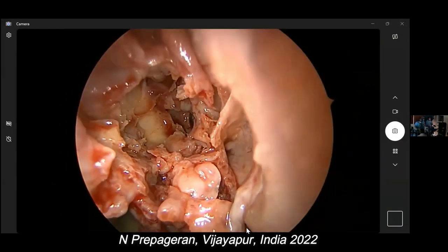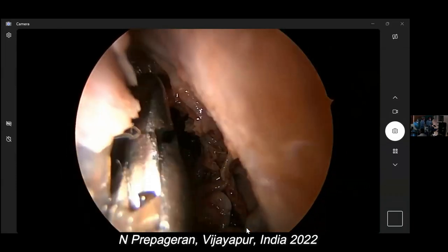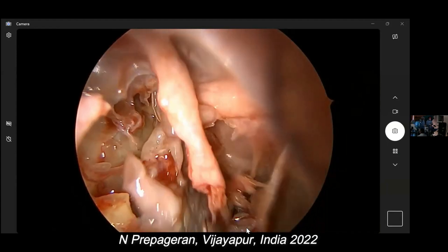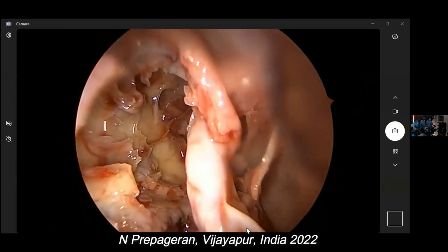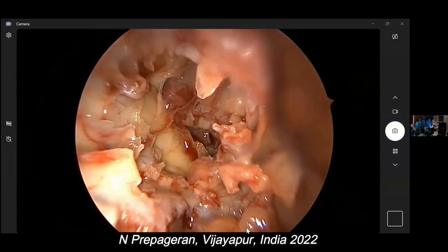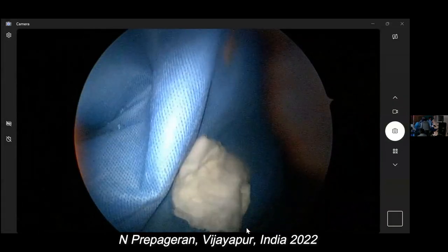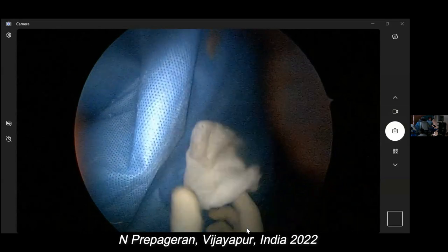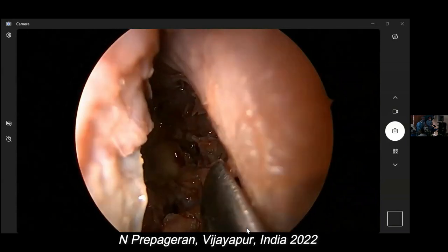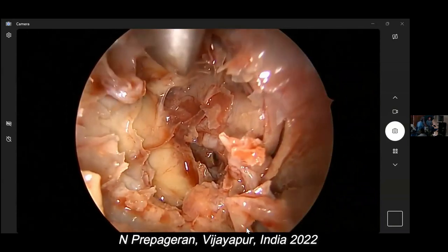So now let me dissect the skull base and remove the mucosa of the skull base, and I can see the anterior ethmoidal artery coming into view. Can you guys see that? Yes, sir. Okay. So how many instruments have we used so far? Two, the suction and Blakesley. That's the anterior ethmoidal artery coming into view.